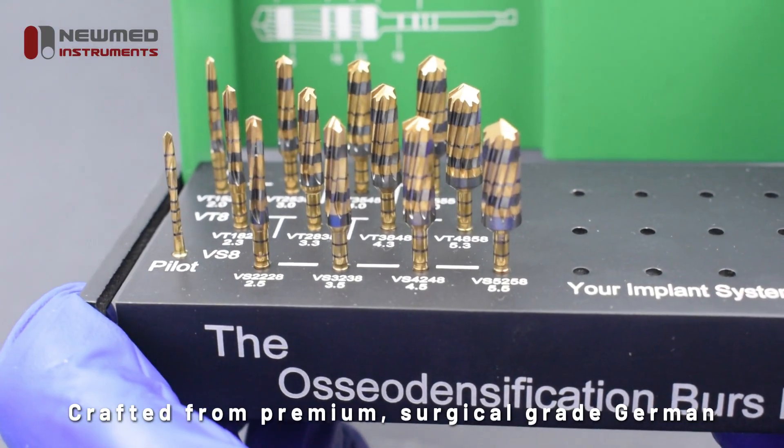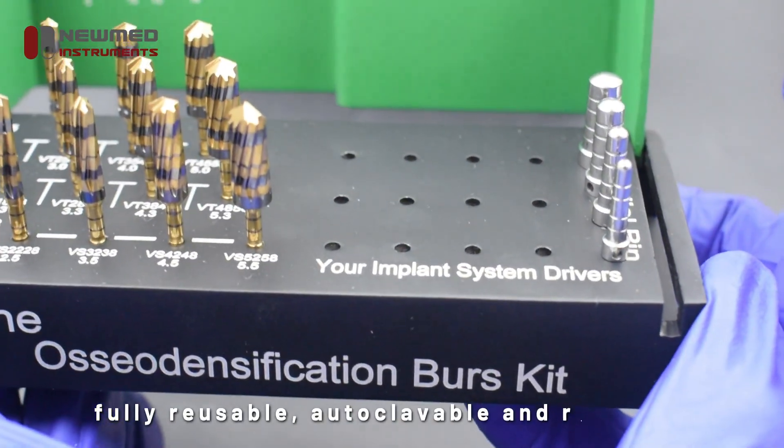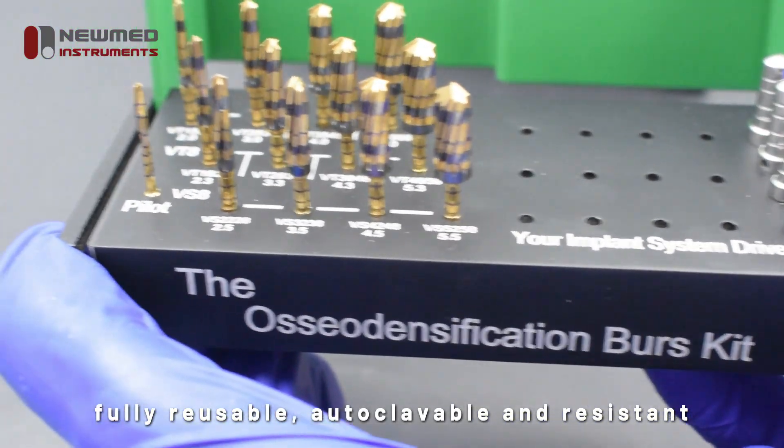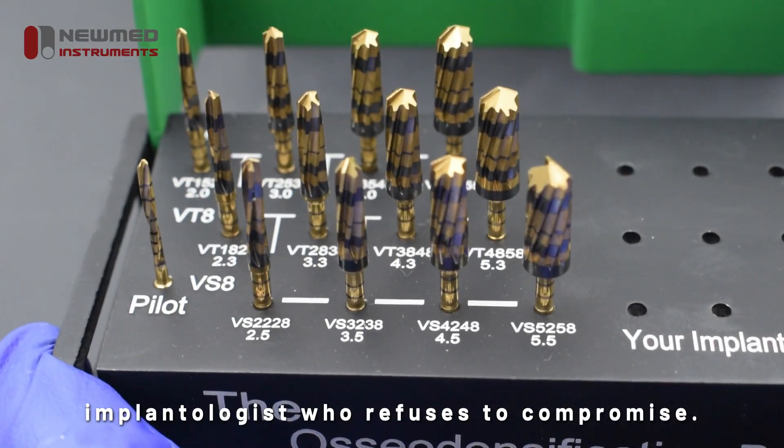Crafted from premium surgical grade German stainless steel, each burr is built to last — fully reusable, autoclavable, and resistant to corrosion. This is a toolkit designed for the modern implantologist who refuses to compromise.